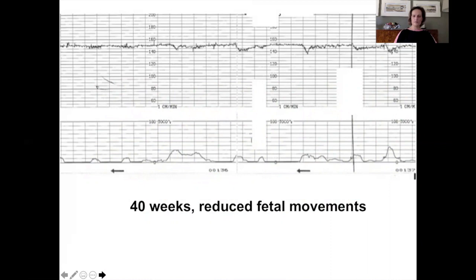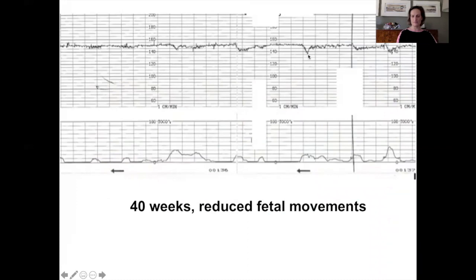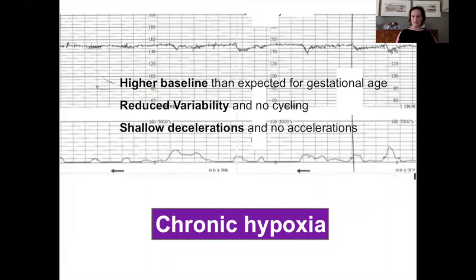This is a baby at 40 weeks gestation where the woman attended with reduced fetal movements. Many babies subjected to chronic hypoxia that have reached decompensation will present with reduced fetal movements. Reduced fetal movements is a very common presentation and only a small percentage will be chronic hypoxia, but it's very important to recognize those on the CTG. The baseline here is 150 — not what you would expect for a 40-week baby. On top of that, there is reduced variability and shallow decelerations. This is a very typical case of chronic hypoxia. This baby was delivered without further stress, pre-labour, and still sustained hypoxia.